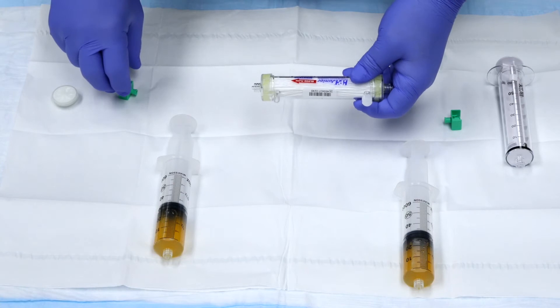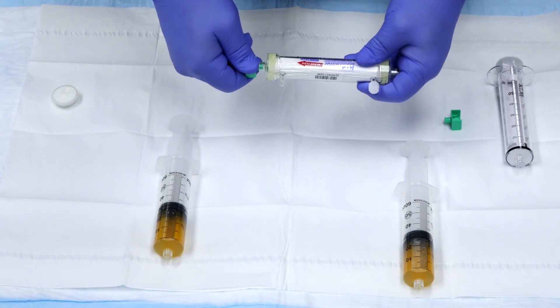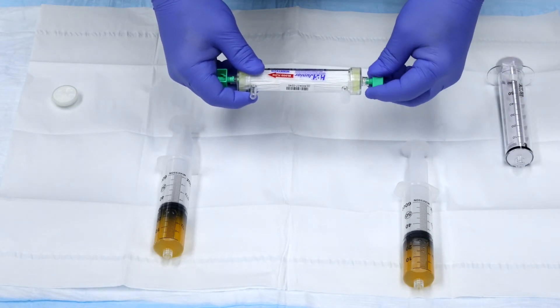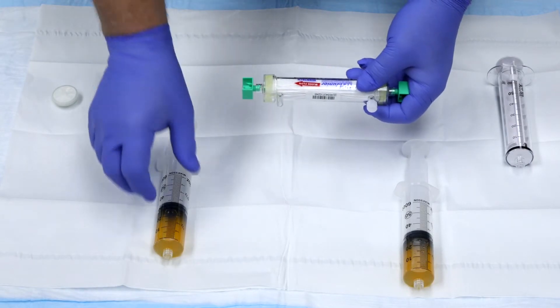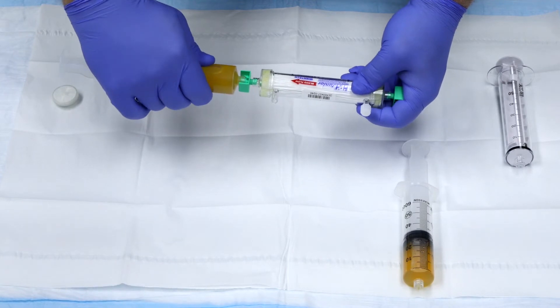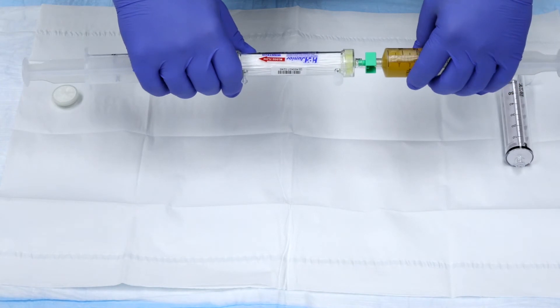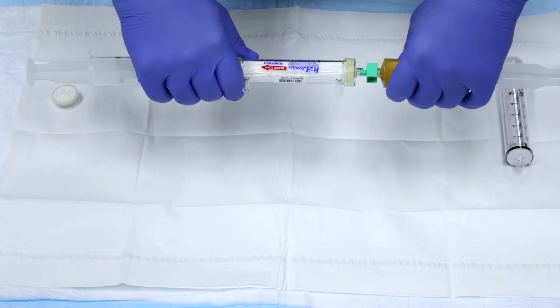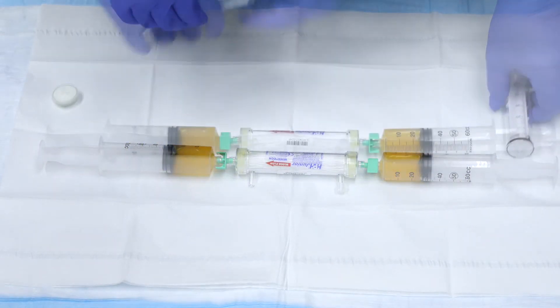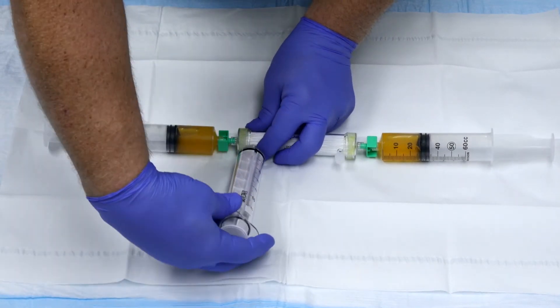To begin, connect the provided adapters to each end of the concentration filter. Take each 60ml syringe of plasma and connect on each side of the concentration filter ports. Then attach the vacuum lock syringe into the open evacuation port.